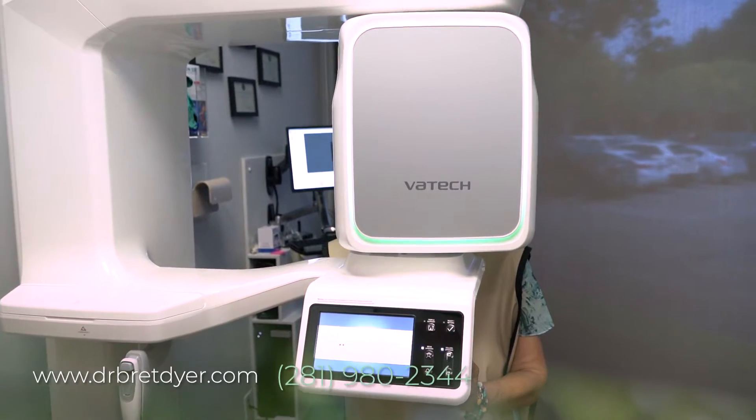We bring a patient in and do an exam to make sure that their gums are healthy. We'll correct any deficiencies in their gum or their bone where the implants are going to go. And then we'll do a 3D x-ray.